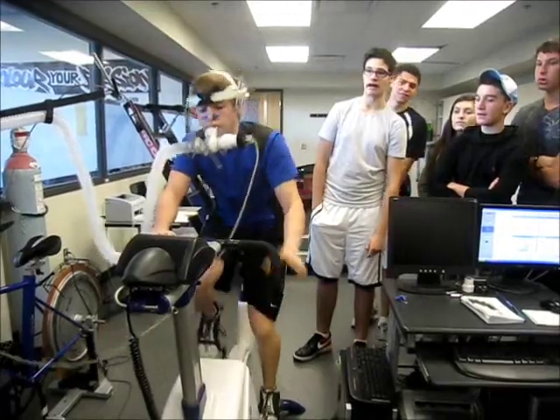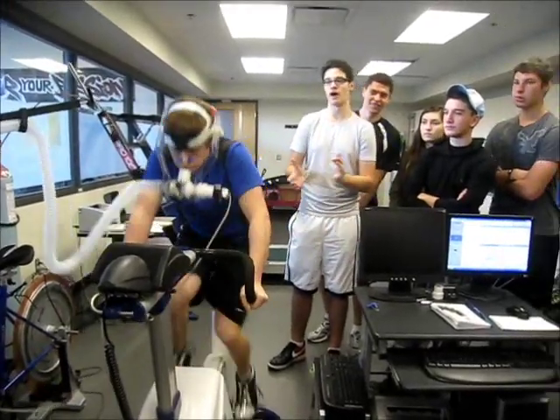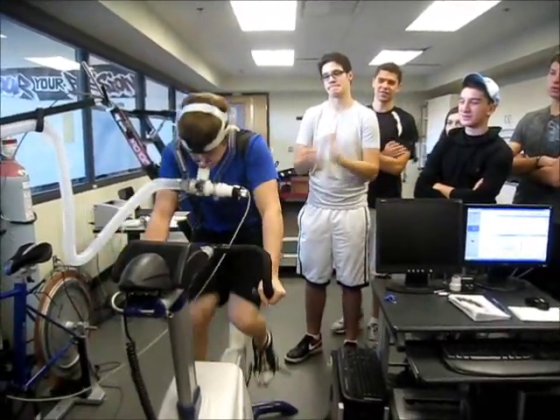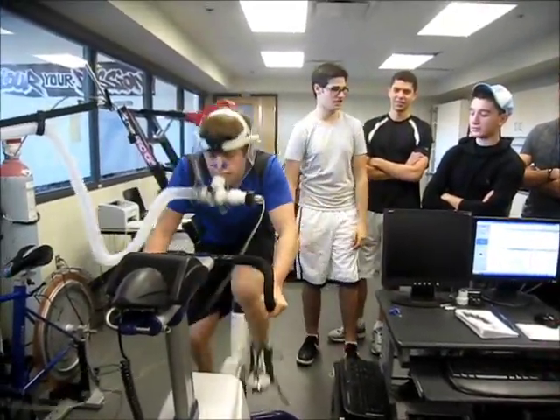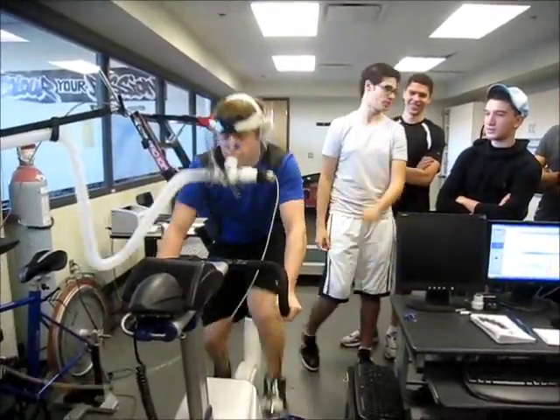His heart rate's around 200, so he may be higher than expected. Yeah! It's 275 watts — keep pushing, Daniel, you can do it!